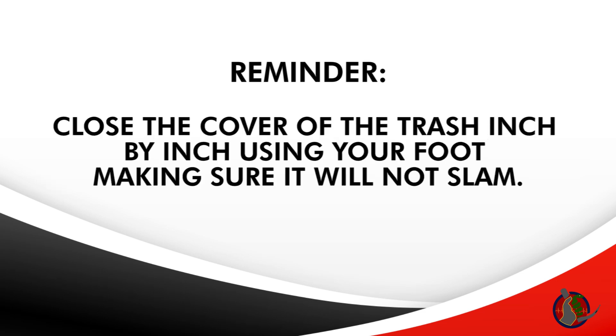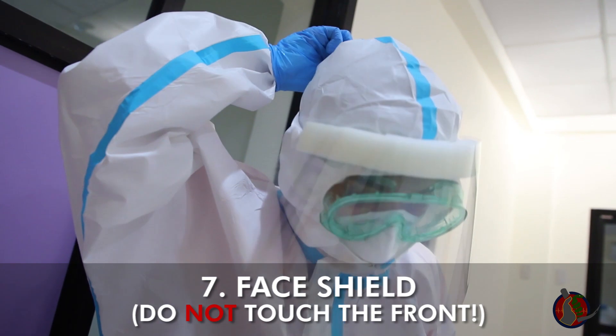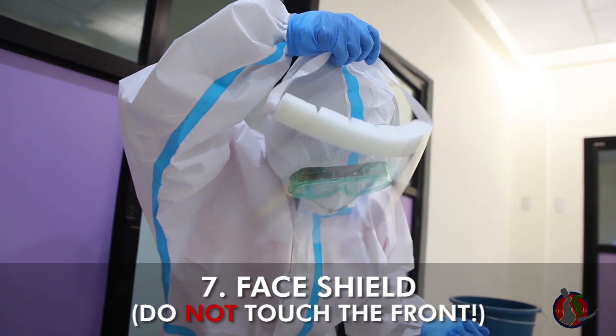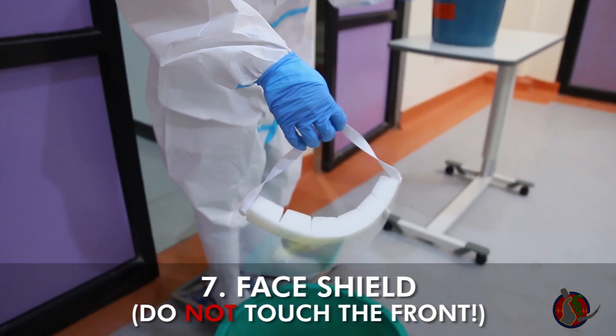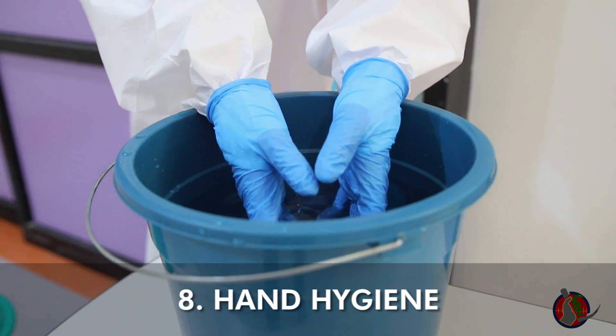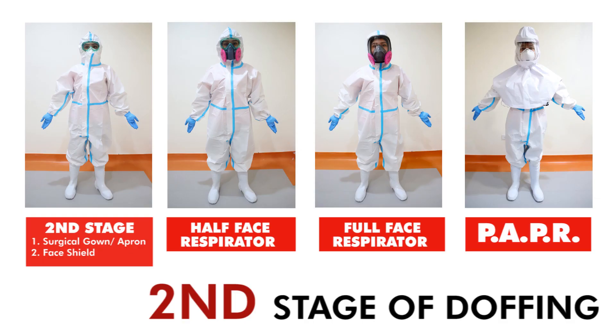Close the cover of the trash inch by inch using your foot, making sure it will not slam. With your head slightly bent forward, remove the face shield pulling from the back of the head, touching only the straps, then throw slowly in the trash bin. Do hand hygiene. You have just finished the second stage of doffing.